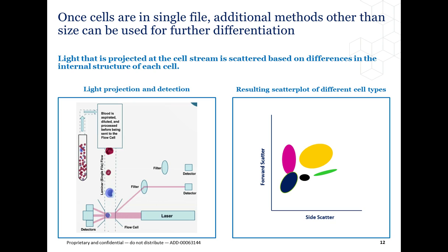This animation demonstrates the use of hydrodynamic focusing and the principles of optical light scatter detection. The focused flow stream of diluted white blood cells is injected into the flow cells we described by hydrodynamic focusing and enters the cell laser intercept area. You can see by the red beam that those cells intersect that.